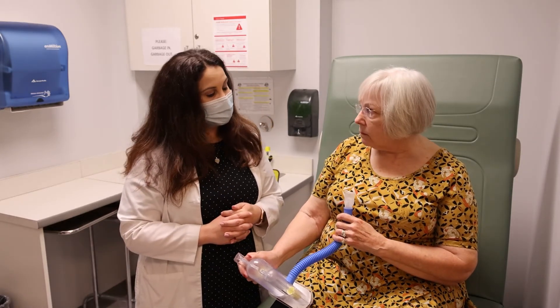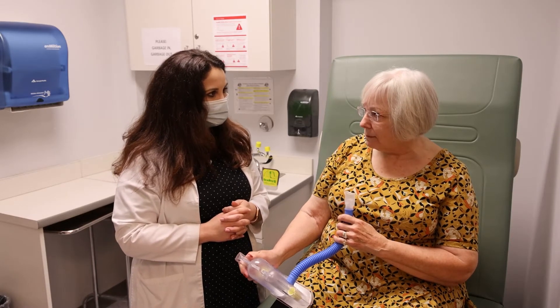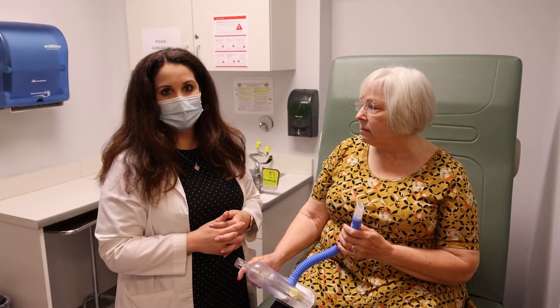Your surgeon is going to give you an S-PAR booklet, and you'll be able to document there how often you do your breathing exercises. You're going to continue to use this device after surgery, while you're in the hospital, and during your recovery at home.